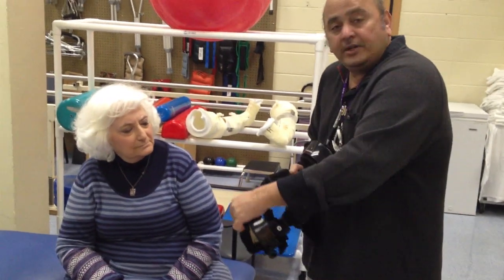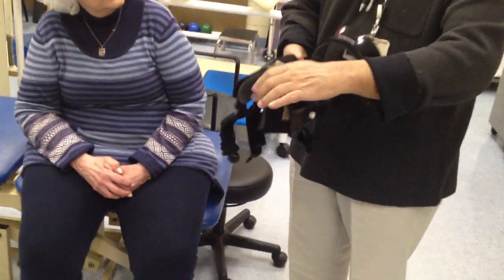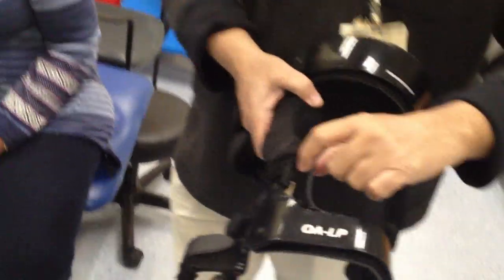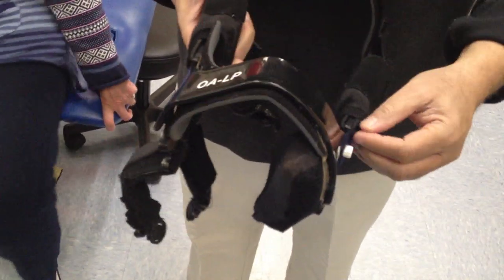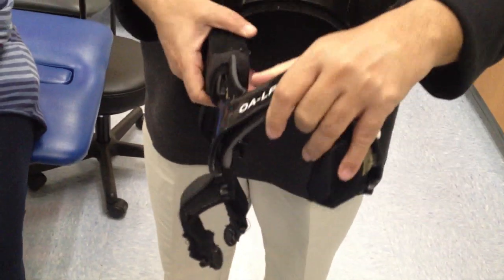It also has special elastic straps, which you can see. There is resistance to these — elastic straps on both sides. They go across here and across here. These elastic straps actually strengthen your muscle as you walk with it.